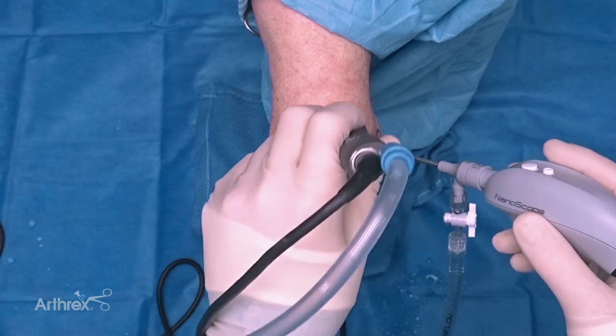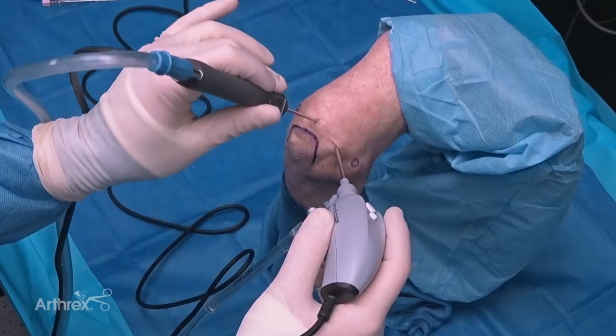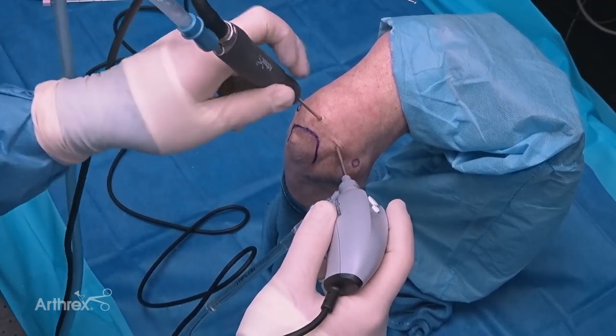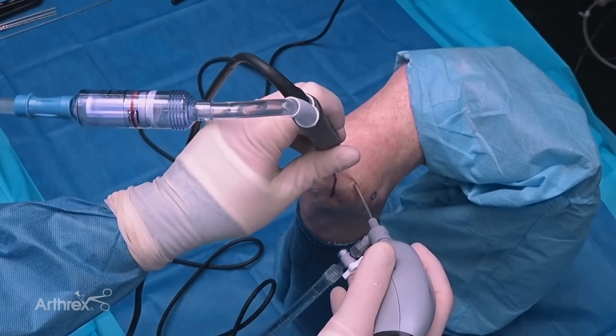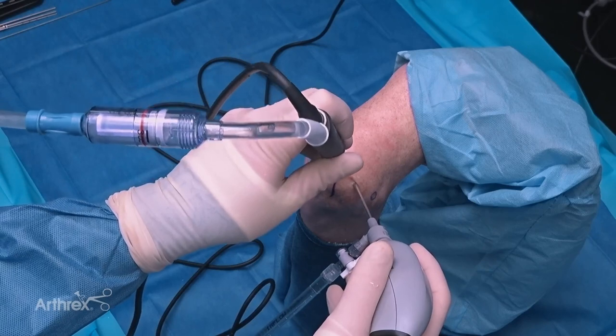You can see it's a much lighter, smaller design, so I'm able to hold it more like a pencil rather than a large blunt instrument, which gives me much more precision. I'm going to turn the flow up and start to debride this chondrocalcinosis, and as you can see, despite the extensive calcinosis, it's doing an effective job at removing this tissue.